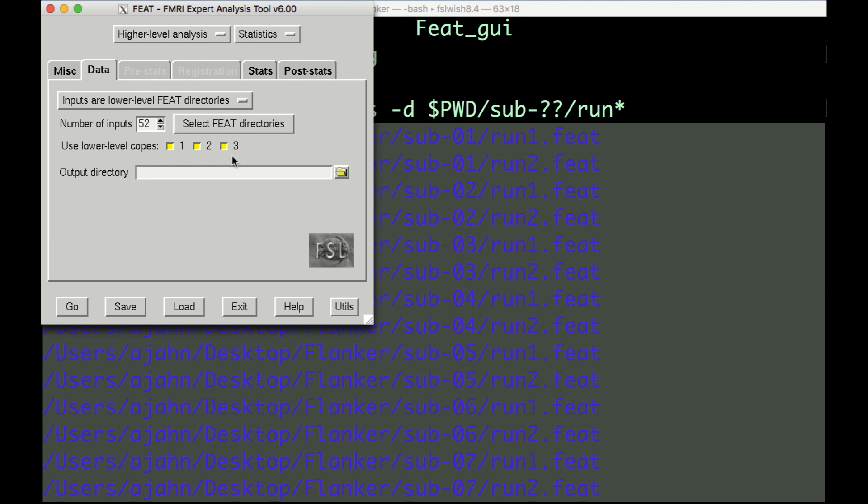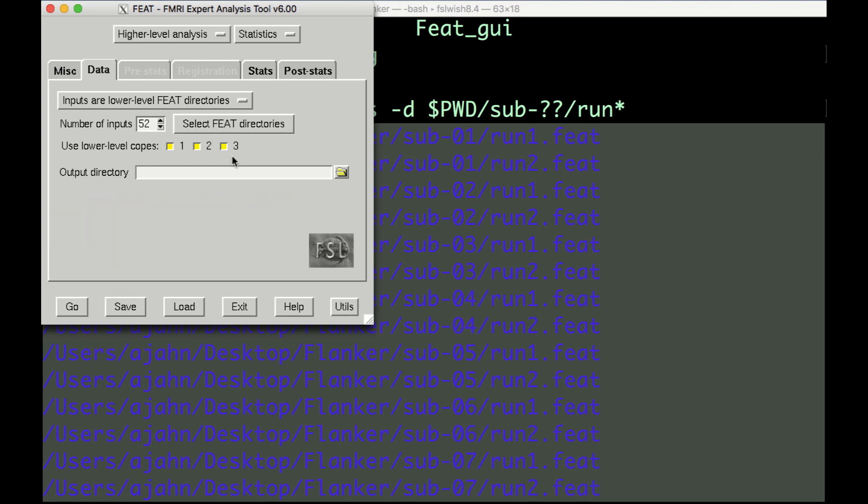If you leave all three of the boxes selected, it will run a second-level analysis for each one, which correspond to: one, the contrast estimate for the incongruent condition; two, the contrast estimate for the congruent condition; and three, the contrast estimate for incongruent minus congruent trials.